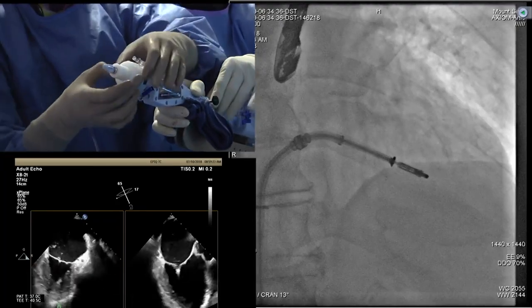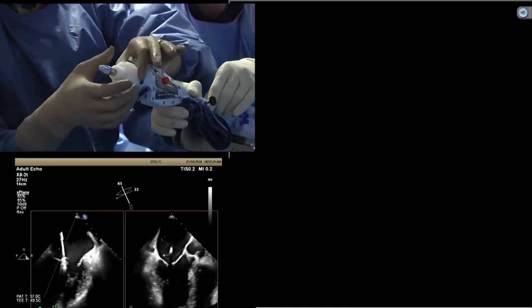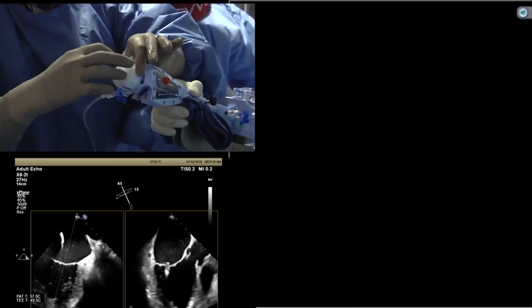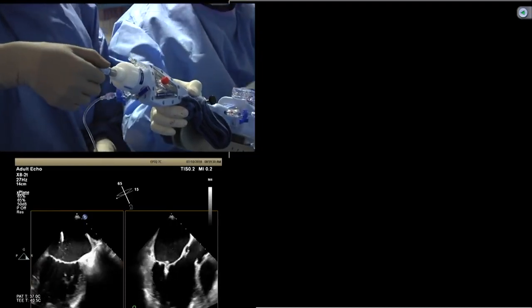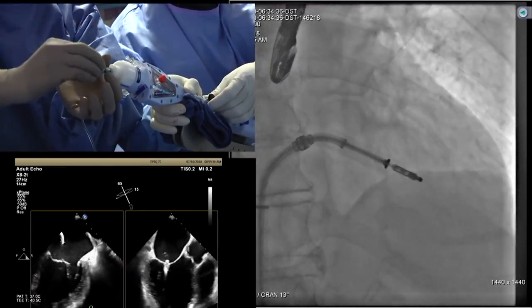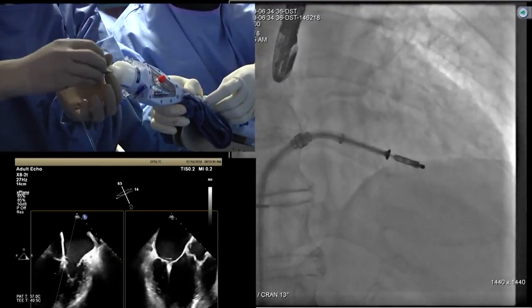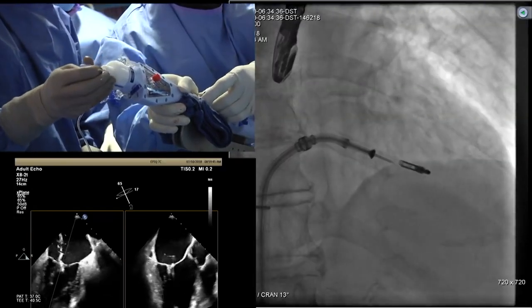So you keep rotating towards us till you start. Here, we are about to release the clip. The ridge, cleft here. First, what you do is 8 times towards us: 1, 2, 3, 4, 5, 6, 7, 8. Okay, good, release. Okay, good.